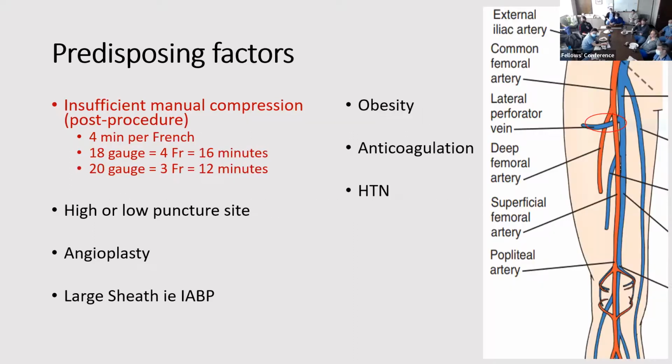What if you just stick it and you're having issues, and for whatever reason you have to take the needle out? Is that as big of an issue? It is, yeah, because it's a puncture. Now, if you have a catheter in there, it's going to be easier for that hole to remain. But if the patient's coagulopathic and hypertensive, you definitely want to hold pressure.